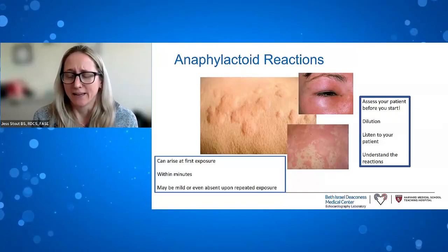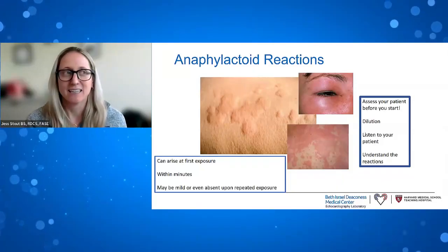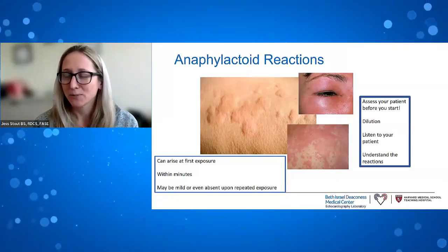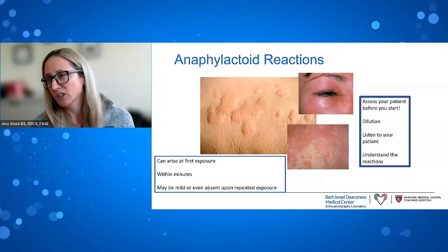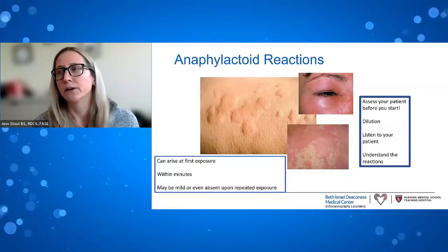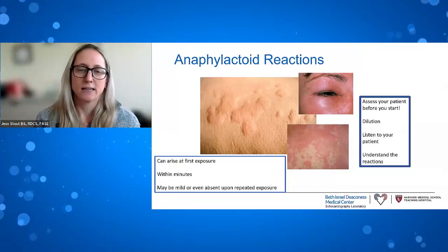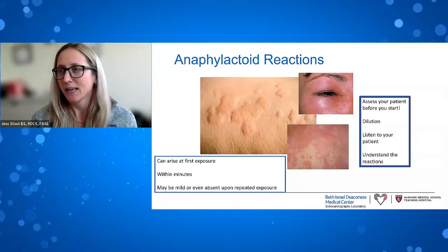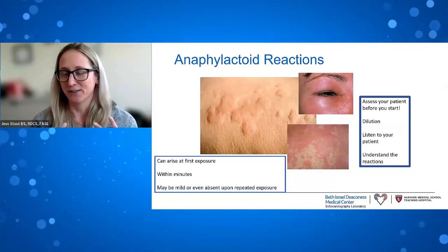And the story of the Kounis syndrome that Jordy mentioned that we went through recently: that patient was a Mandarin speaking male, and I had an interpreter on the phone the entire time that I was doing the echo. I explained the contrast, and when I was almost all the way done, I said to the interpreter, let me let you go. You're just sitting on the phone. I'll call you if I need you. I finished the study, did the contrast, and of course pushed the contrast, and the patient just looks at me and says, hot. And I was like, oh crap, and then immediately you could see the rash and the redness.